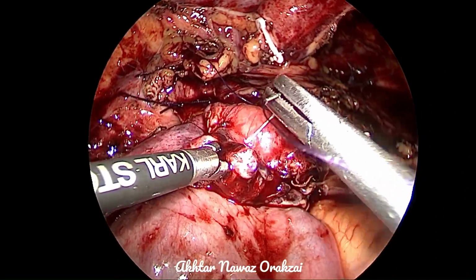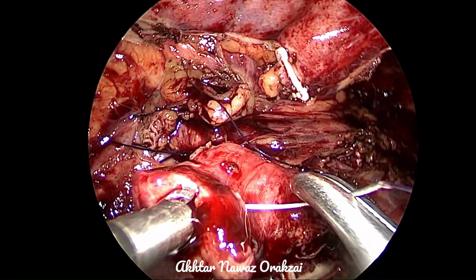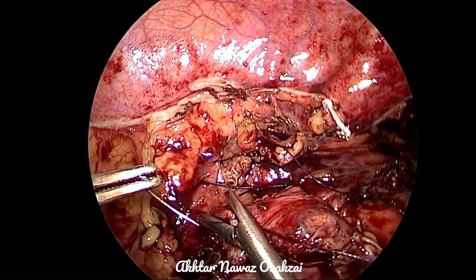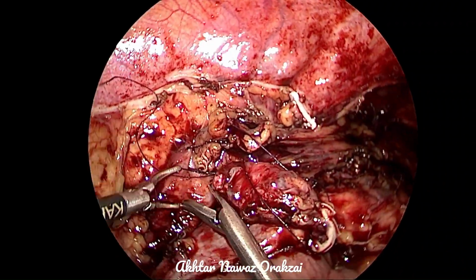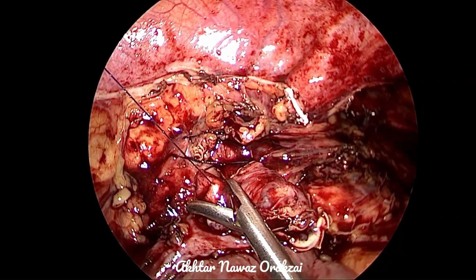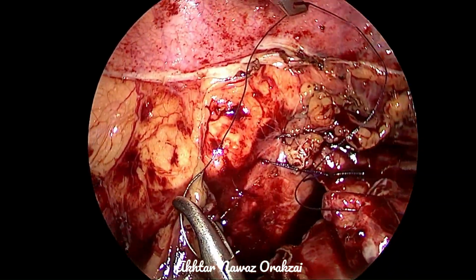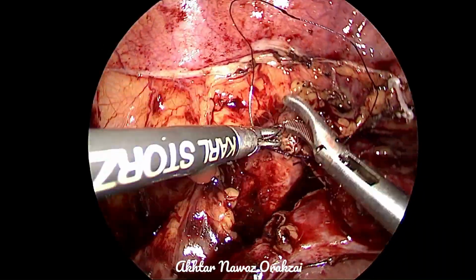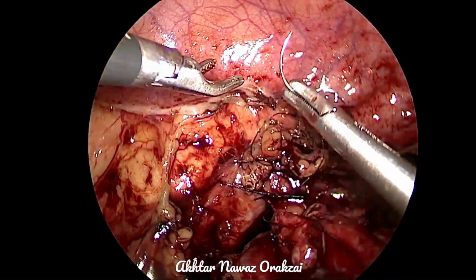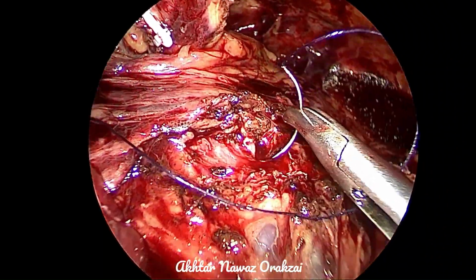At this point, the step is important to take the exact corner and not catch the opposite wall. The first stitch is really very important. Not only the first stitch, but the first few stitches. So there are different methods of anastomosing this ureter to the bladder. It can be done in interrupted suture fashion, and it can be done in continuous fashion.